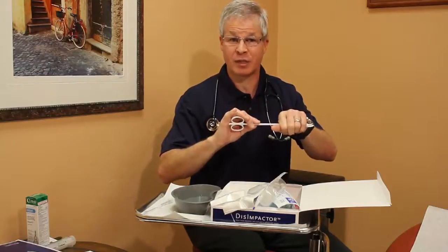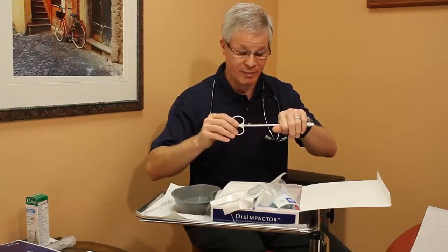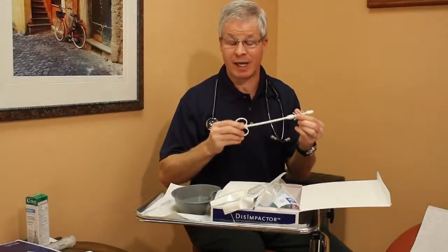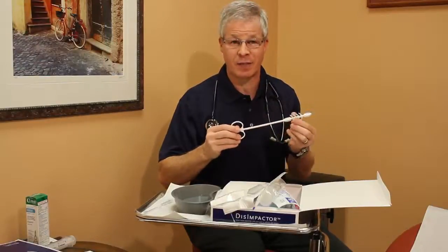At that point, patient should have tolerated that fairly well, and we can now begin the gentle manipulation with a clockwise, counterclockwise movement and begin to encounter the fecal load. What will happen is you'll stay within the long axis of the fecal load, and you'll, through the tactile feedback, feel the device entering it. Our goal is to get all of these fins to engage within the fecal mass. So rarely do we need the entire length of the device.